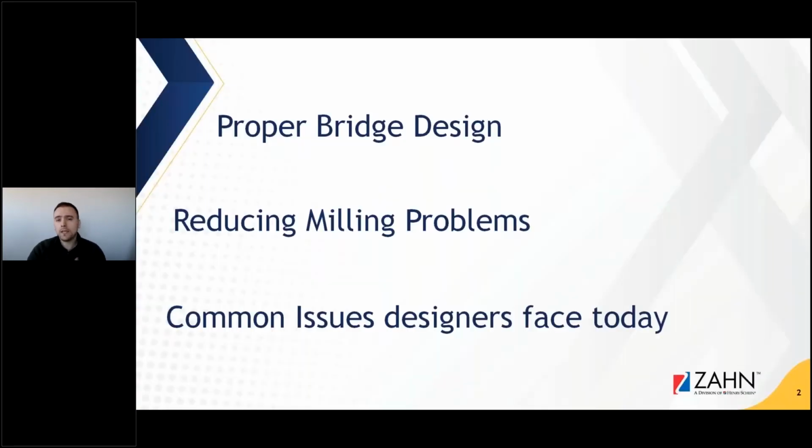So again, proper bridge design is something that we find a lot of designers happen to neglect, especially when it comes to force distribution and the connectors in your design. This will help you reduce your milling problems. Then we're going to switch focus to common issues designers face today and what to look out for in digital files. So, a pretty quick rundown on some of these things.